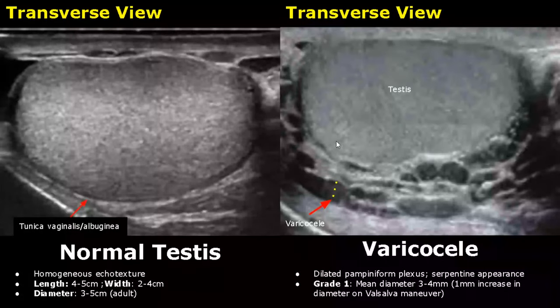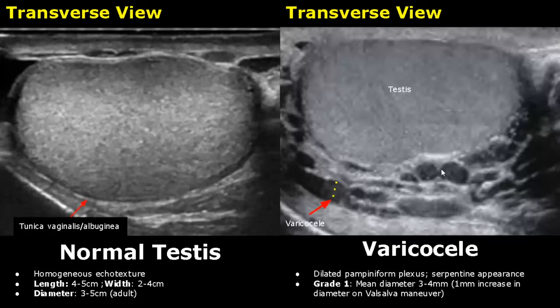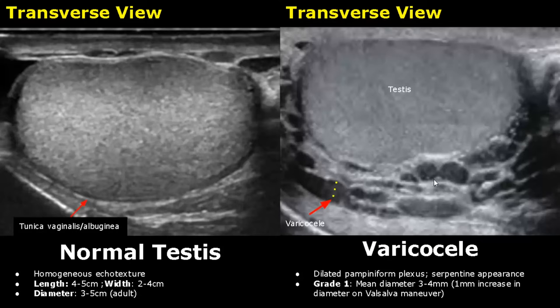A varicocele means there is dilatation of the pampiniform plexus, which are various small veins in the spermatic cord. The dilated veins give a serpentine appearance. There are different ways to grade a varicocele; the one used here is based on mean diameter of the veins. In grade one, the mean diameter is 3 to 4 millimeters, and on Valsalva maneuver there is a 1 millimeter increase in diameter.